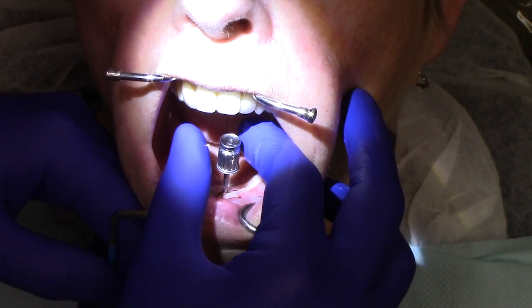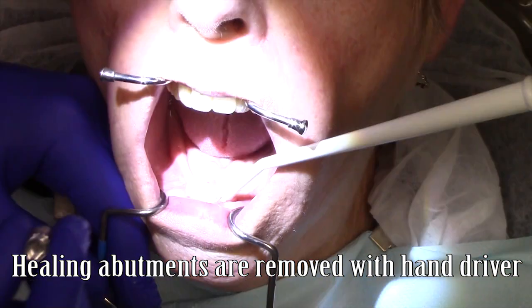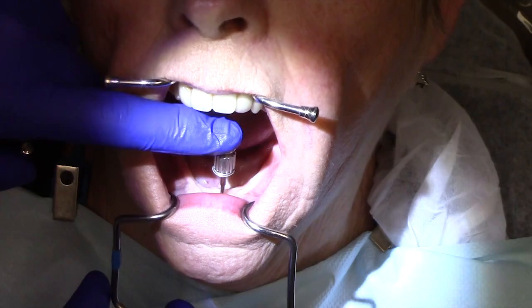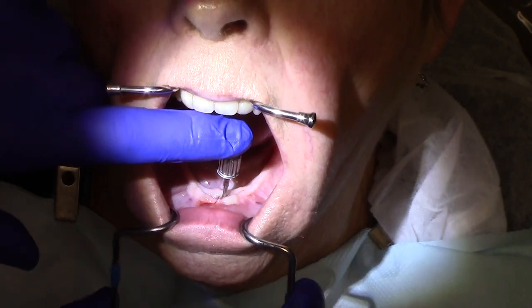Hello, this is Dr. Michael Shear with the Learn Locator, a free resource on how to treatment plan, utilize, and maintain locator and locator RTX attachments for overdentures. This clinical demonstration video describes the clinical technique to uncover a dental implant, remove the healing abutment, and place four locator RTX abutments.